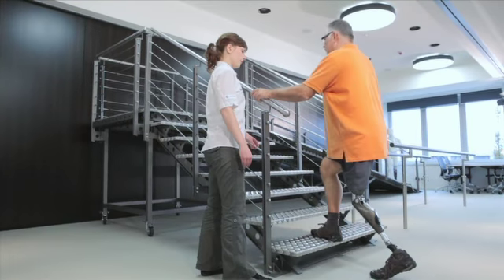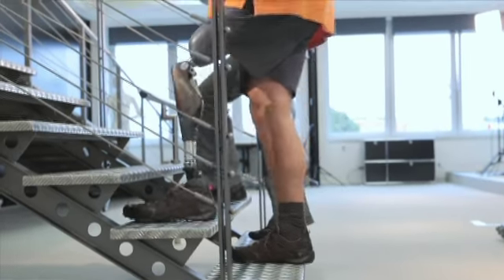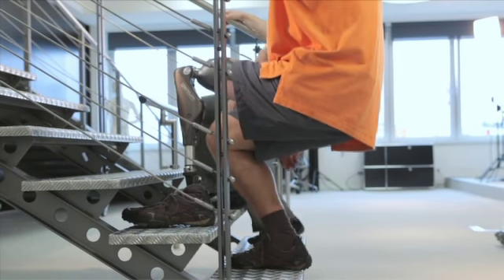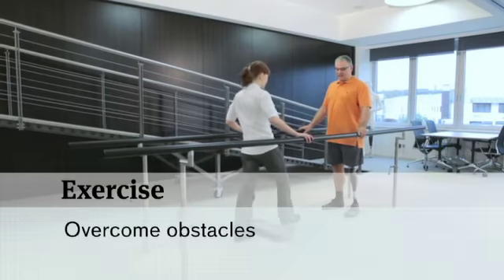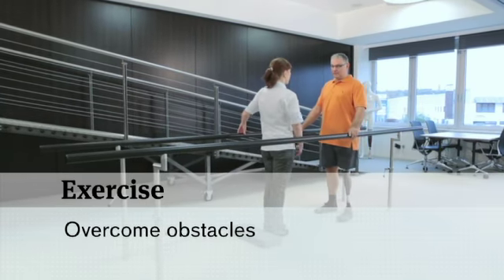It's particularly important here that you make the user aware that he can stop this special behavior of the knee simply by stopping or changing the movement. This function can also be used to step over an obstacle.